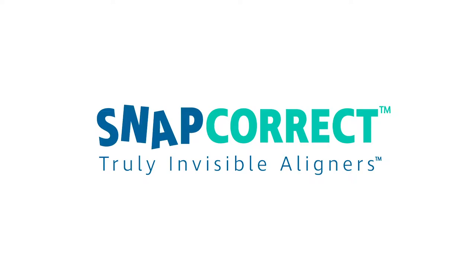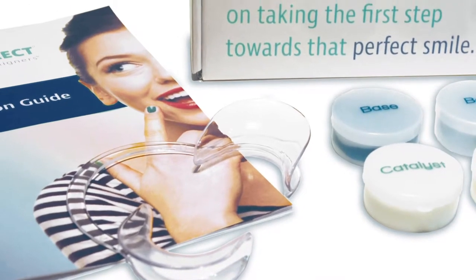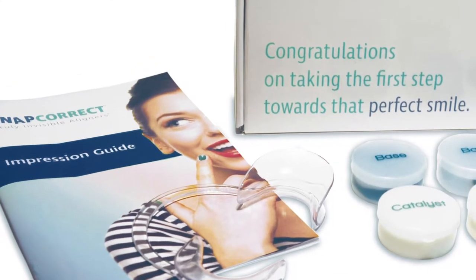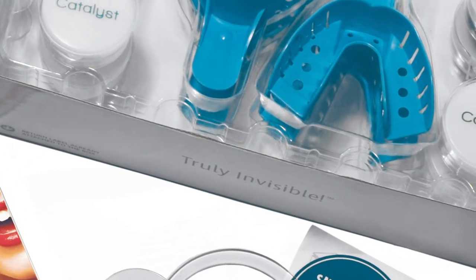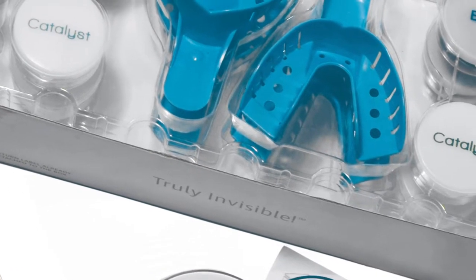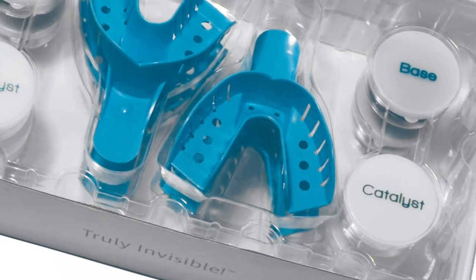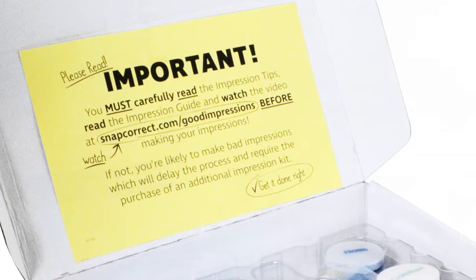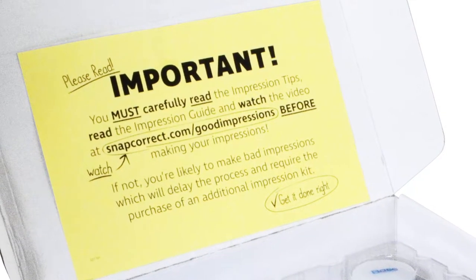Congratulations on choosing SnapCorrect, the clearest and fastest way to your perfect smile. In this video, we are going to show you how to make great impressions for your SnapCorrect aligners. Before starting your impressions, please watch this entire video and read the entire impression guide that comes in your impression kit. We need great impressions to help our dedicated dental experts accurately produce customized SnapCorrect aligners tailored to your smile. Please be patient and follow the instructions very carefully to ensure you create the best impressions possible.